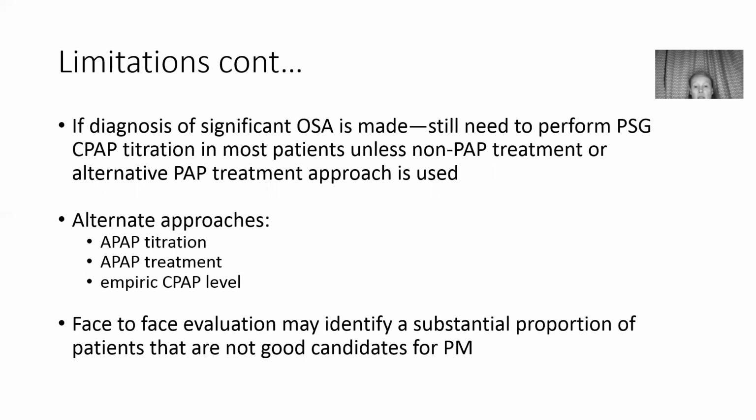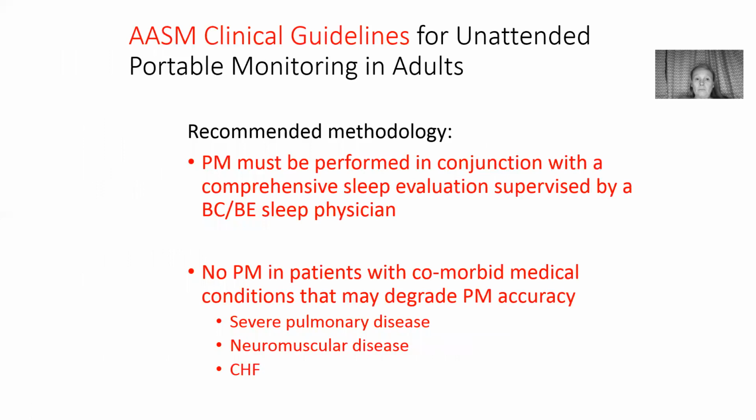A face-to-face evaluation may identify a substantial proportion of patients that are not good candidates for portable monitoring. So the AASM clinical guidelines for unattended portable monitoring in adults, their recommended methodology is that portable monitoring must be performed in conjunction with a comprehensive sleep evaluation supervised by a sleep physician.